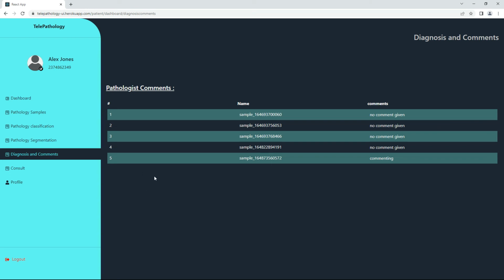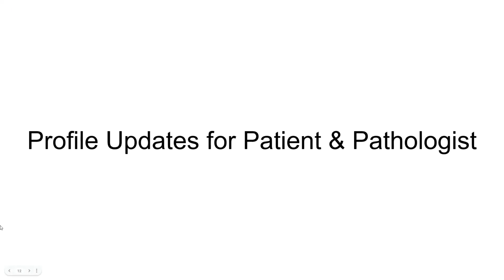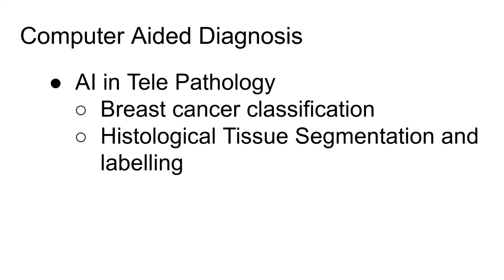Thank you, Pawan. You did a good job. So now I'm going to explain what are the new things that we have added apart from the existing things that everyone builds upon. We had added the sample uploads from the patient side. And the computer-aided diagnosis is a main part of AI-based telepathology. We had two things in computer-aided diagnosis.